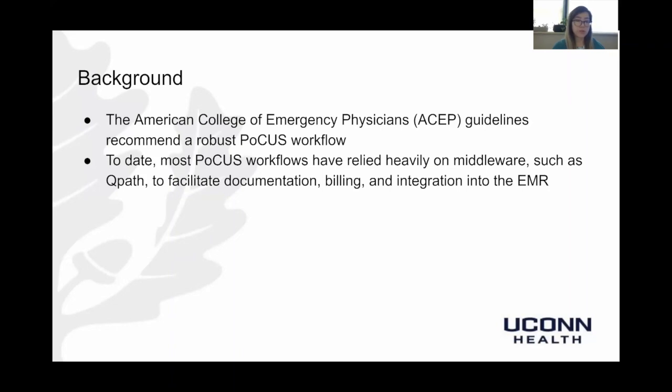To date, most workflows have relied heavily on middleware such as QPath, for example, to facilitate documentation, billing, and integration into the EMR. However, some hospitals are reluctant to purchase third-party middleware and would prefer an in-house workflow that does not rely on external technical support, cloud storage, or additional expense.